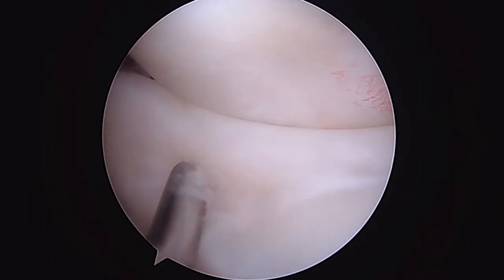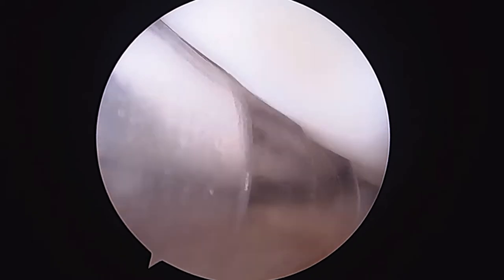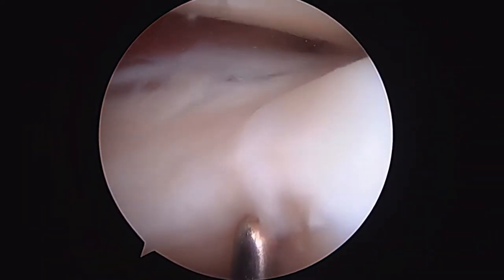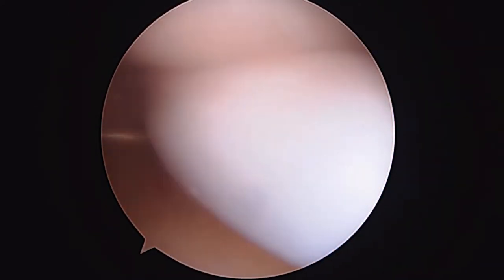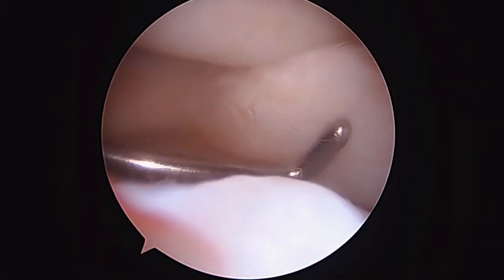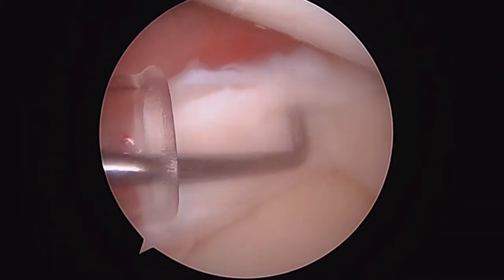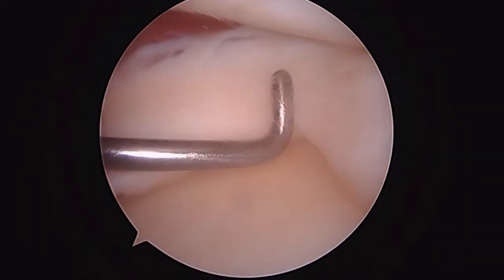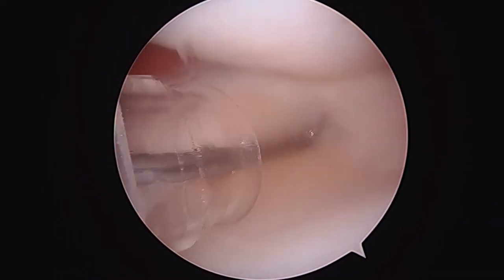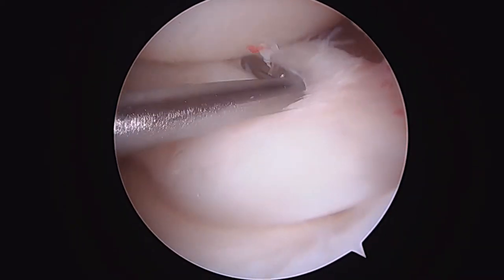We're going to take this probe and reduce the meniscus. It partly helps to put a little bit of valgus on the knee. What's my pump pressure set on? Let's go up to 44. You can see we're getting there — it's reducing a bit. That looks a little bit better. You can see the inner edge, and rather than just take this meniscus out, we're going to do our best to save it. Now we're getting to see the posterior horn a little better too. The meniscus is reduced — it's not really a root tear; the root looks intact.